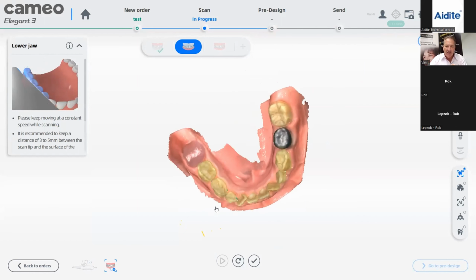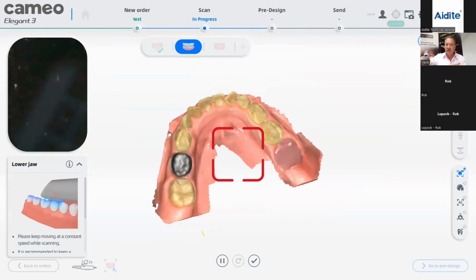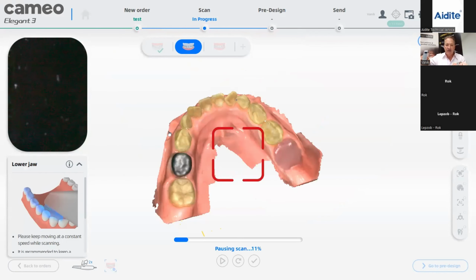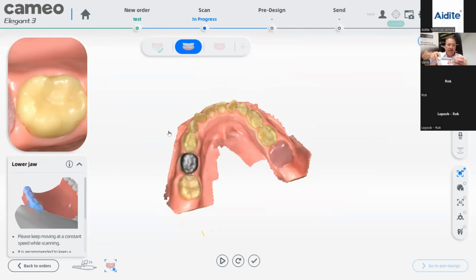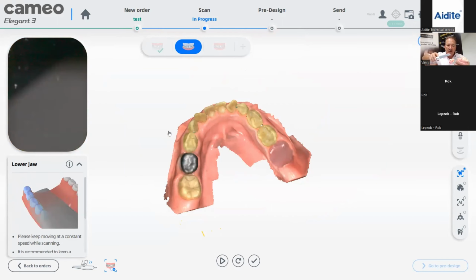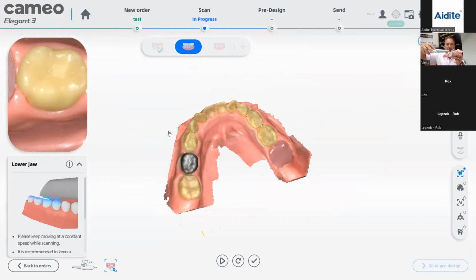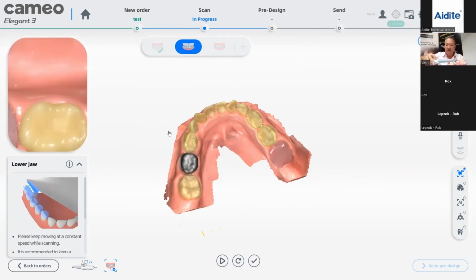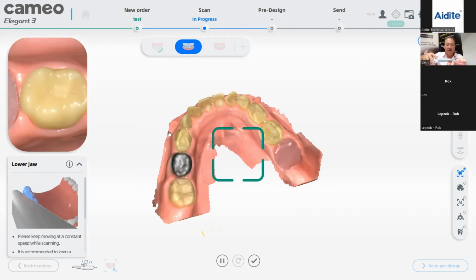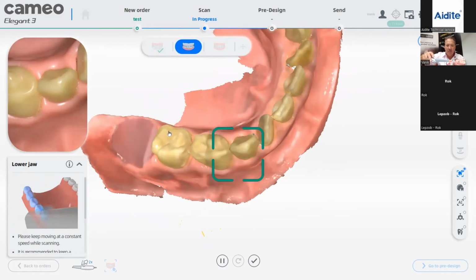Let's say you want to scan this area here. Always put your tip on here, on the molar. I will just show you first. Let me switch off the scan possibilities. So normally put your tip always on the molar here or here, because here you have most of the fissures, and start from here to go to this point. Don't just go to this point here. Always start at the molar and try to keep everything parallel, not like this and not like this. Parallel is the easiest. So when I switch this on and I go to the molar, then I can go to this point here, which was not good. So always look for an area which is very markant.